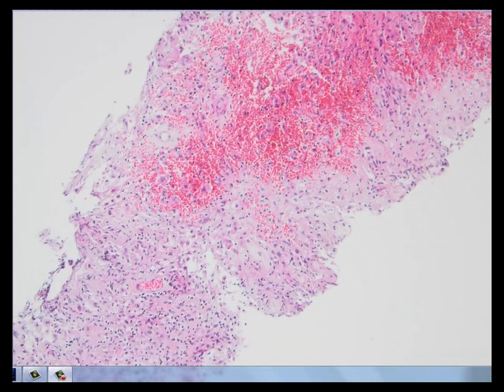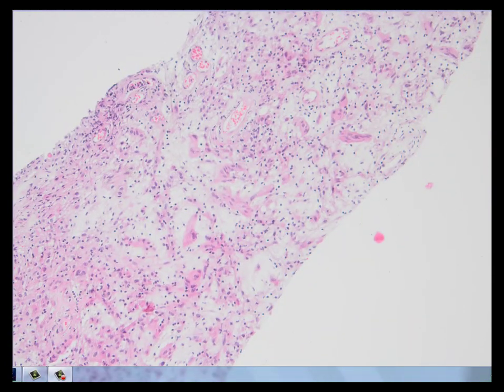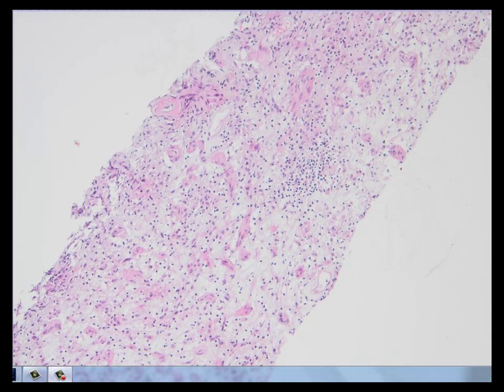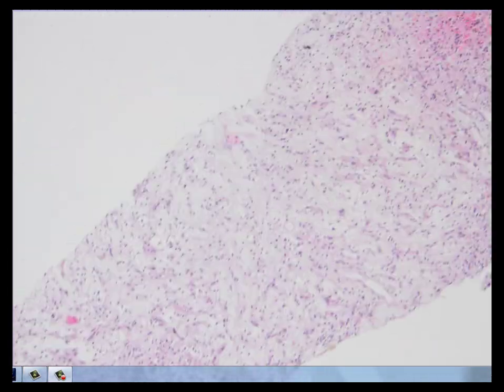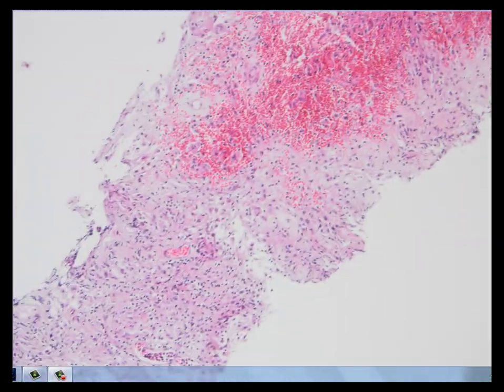So actually you don't need so many immunos here, but if you think of an intra-abdominal tumor, you may consider dedifferentiated liposarcoma, sarcomatoid carcinoma, leiomyosarcomas and GISTs. But in this case, the morphology speaks a lot more than immunohistochemistry. And here we have more degenerating areas. So we have these hypercellular and hypocellular areas, and we have these hyalinized vessels with lots of extravasated erythrocytes.